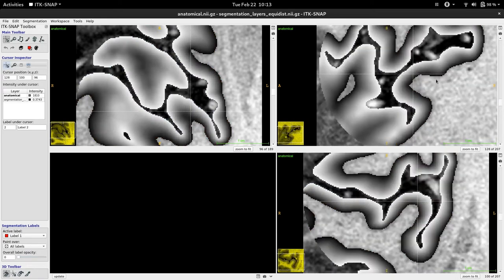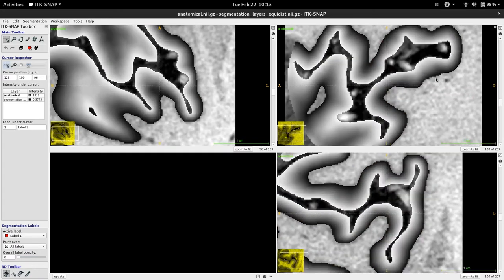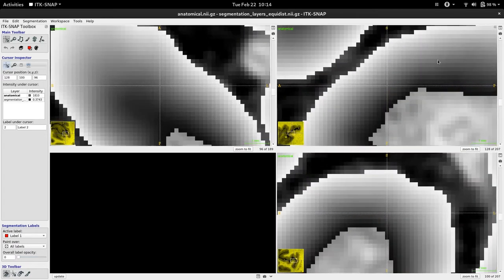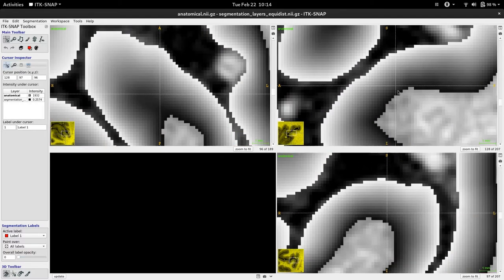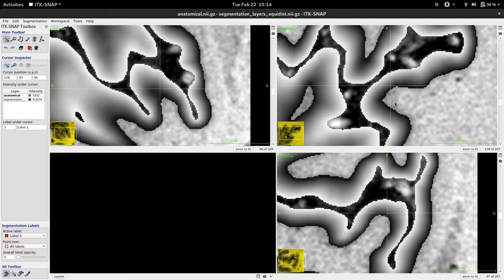Therefore, once you have this metric output you can decide on how many layers you want and write a simple program to bin this 0 to 1 range by yourself.